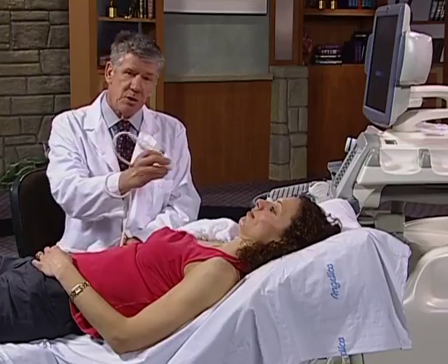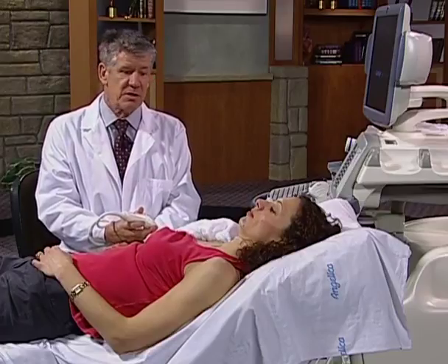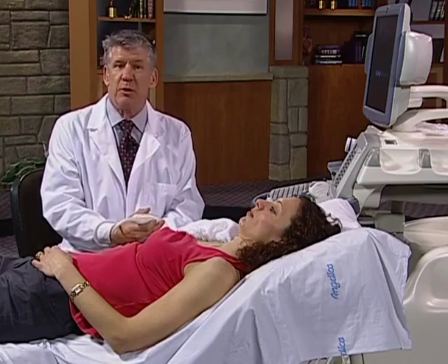So even though I've taken quite a bit of time to demonstrate all these sample spots, in reality the exam can go quite quickly with just sampling in 2 or 3 spots and using your color Doppler to guide you through for the presence of any flow disturbance.